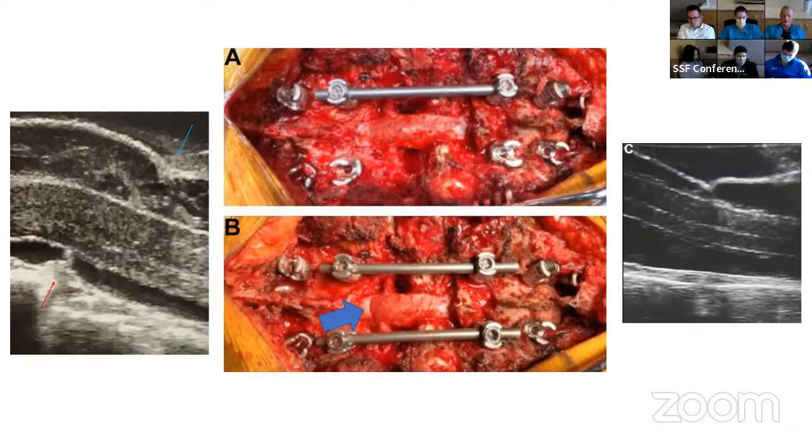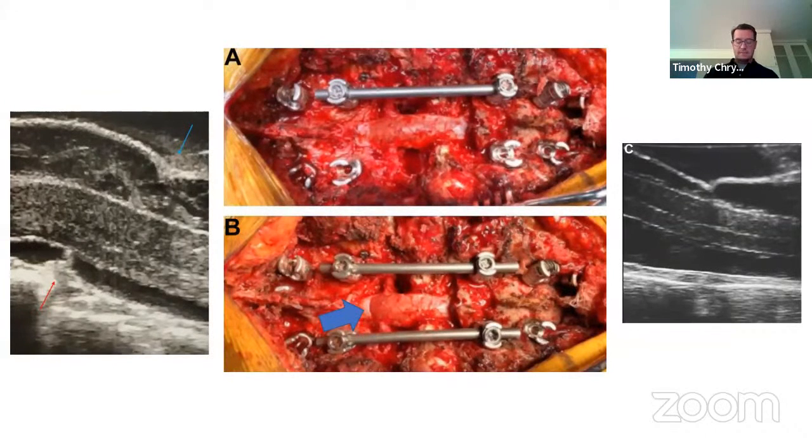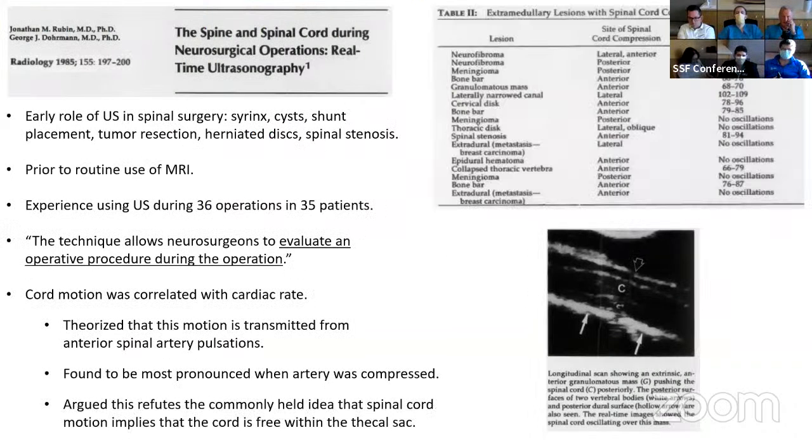So I also asked for clarification of one statement you made before that I may or may not have understood correctly, and that is cord pulsation. When I operate on a cord at risk, I really look at pulsations as a good sign. Let's say I've had neuromonitoring changes, and the first thing I want to do after MAP adjustments and whatever further decompression, I want to see cord pulsations. Now, please go back to your sentence again, and I think its relation to that 85 paper by Rubin et al. Is cord pulsation a good thing then?